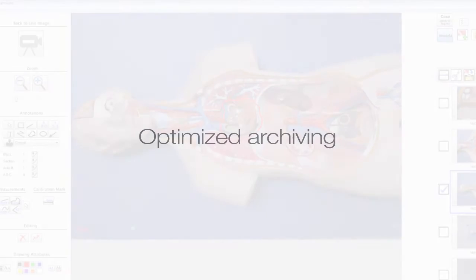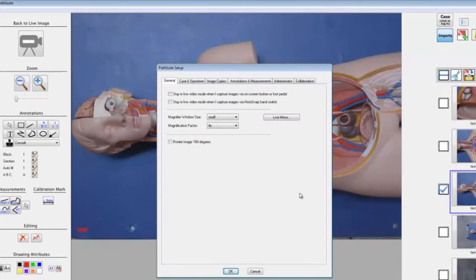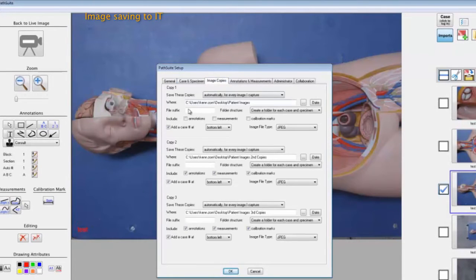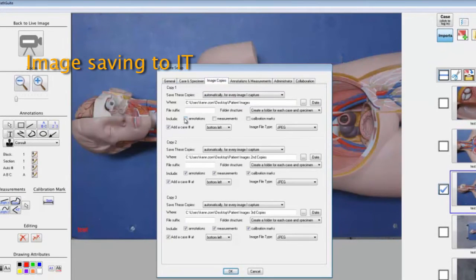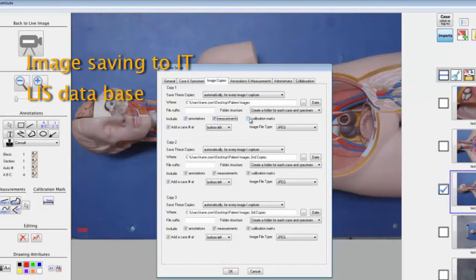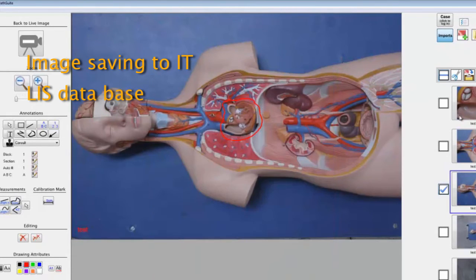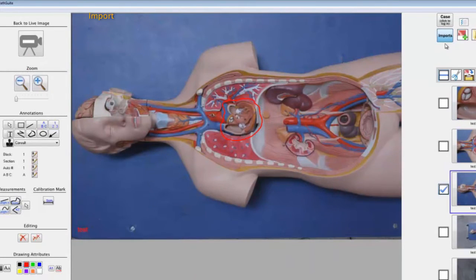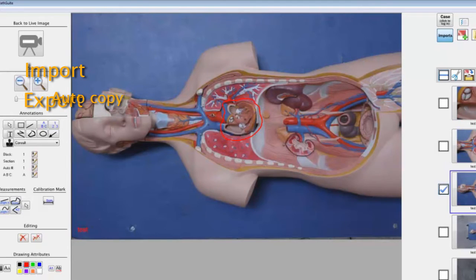PathSuite's optimized archive interface automates image saving to your IT file server as well as your LIS database. Additionally, PathSuite provides image import, export, and autocopy interfaces, ensuring easy management and sharing of your images.